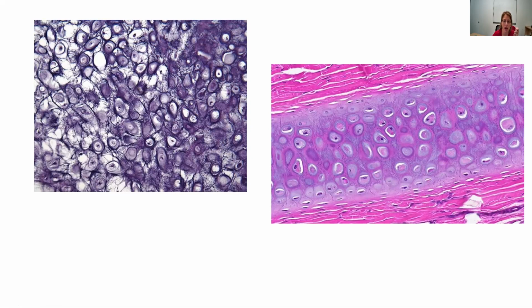Neurons. Well, I do feel like this kind of looks like it has an eye and this kind of looks like it has an eye. However, that doesn't really look like neurons to me. Instead of neurons, these look like lacunae with cells inside. And maybe instead of that being the nucleus of the eye, maybe that's the cell inside a lacuna.